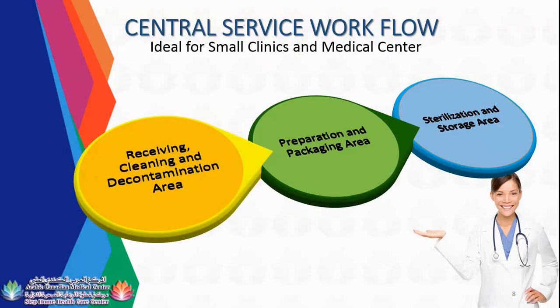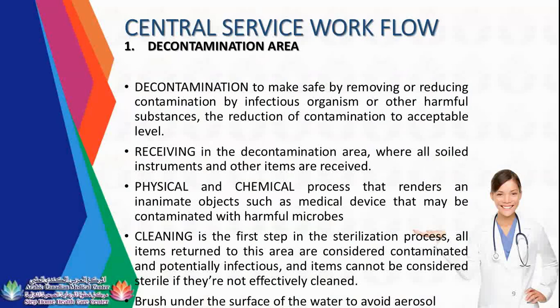So, the decontamination area, where once you receive your soiled instruments, you need to do manual brushing. So, manual brushing is removing of just a moment.